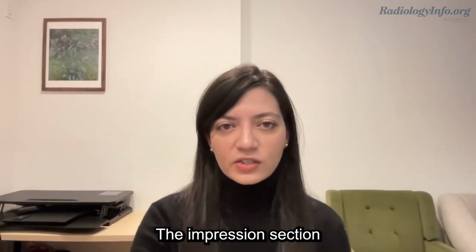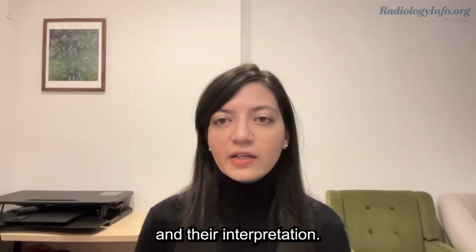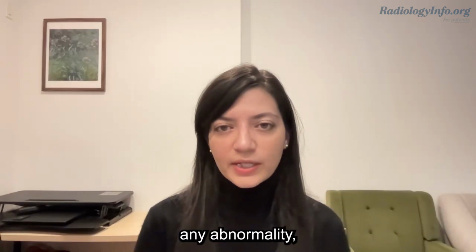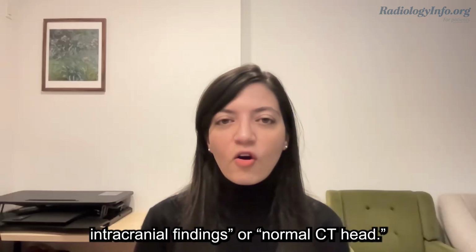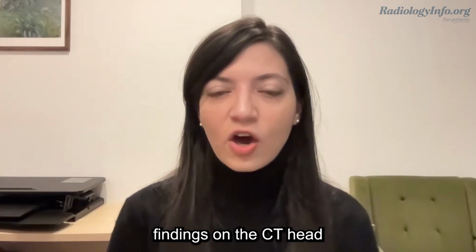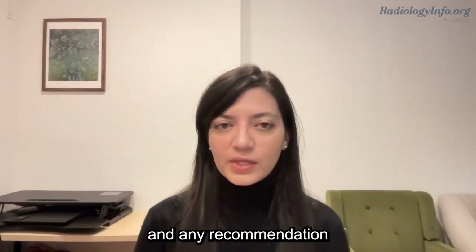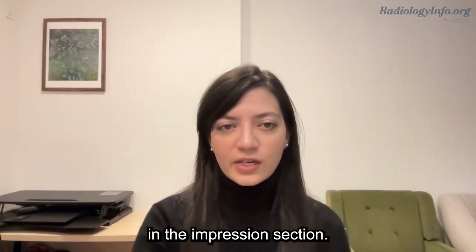The impression section of your report summarizes the findings and their interpretation. If the radiologist does not identify any abnormality, the report might state no acute intracranial findings or normal CT head. Keep in mind that it is common for a radiologist to identify findings on the CT head that may require further imaging, and any recommendation for additional evaluation will be mentioned in the impression section.